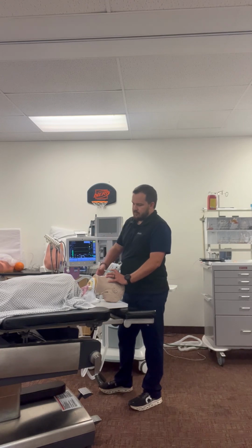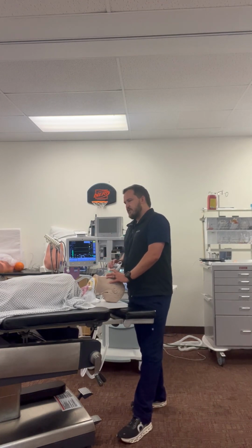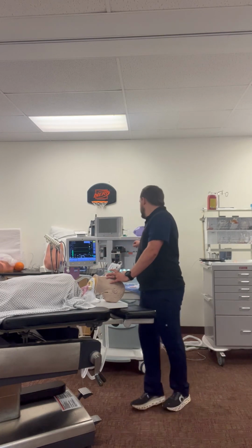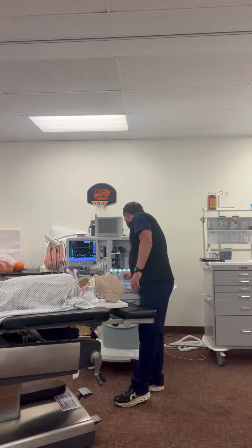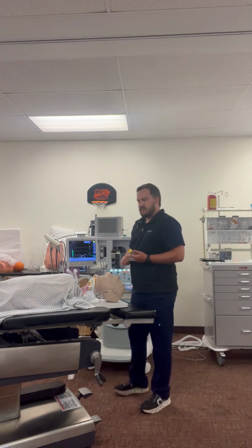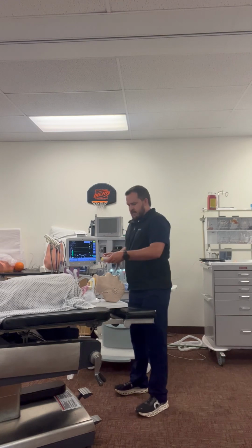I'm going to now put the patient into the sniffing position, make sure his airway is good and open for me, give him a couple breaths to make sure I can ventilate, and then we're going to turn off my gases. I'm going to leave this right here, and now I'm going to get my equipment ready to intubate. We're going to give the dose of propofol and fentanyl, and then I'll have my ET tube ready to go.